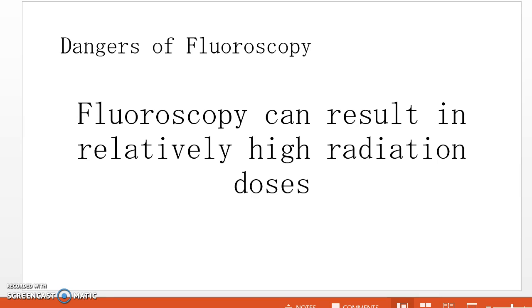So on the PowerPoint I wrote, fluoroscopy can result in relatively high radiation doses because you're being continuously exposed to the radiation. Just make sure you're not standing directly in the beam if you don't need to be. Making sure to be accurate but also fast.